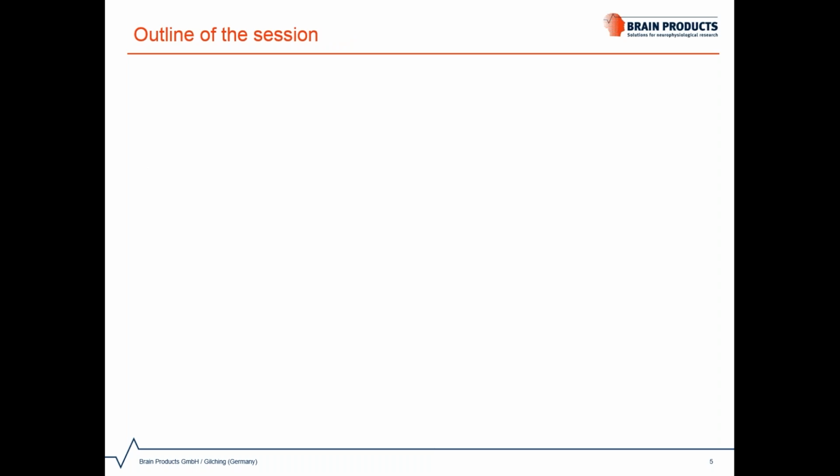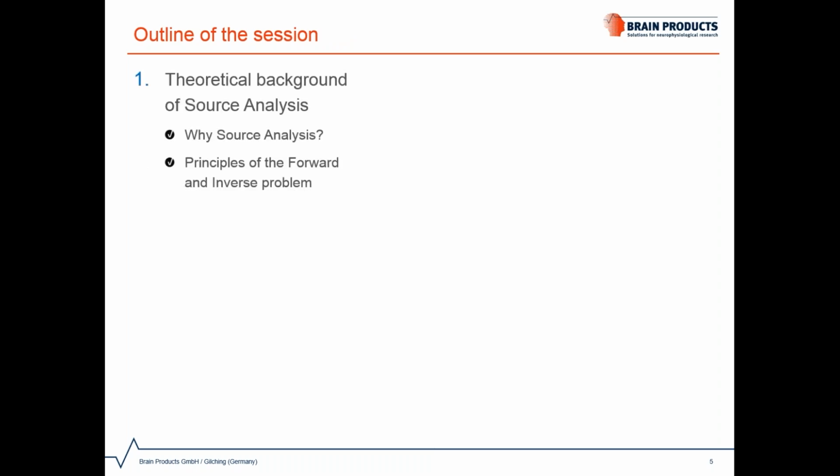Okay, let's move on to the contents for today's session. We will begin with the theoretical background of source analysis, including the rationale behind it, along with the two main ingredients of source analysis, which are the forward and inverse problems.